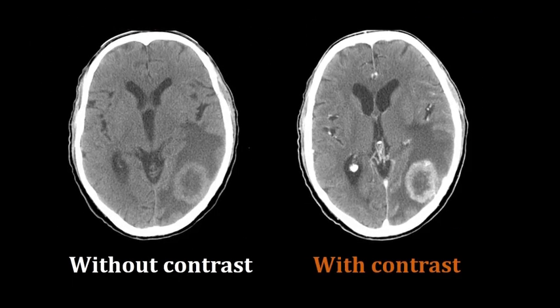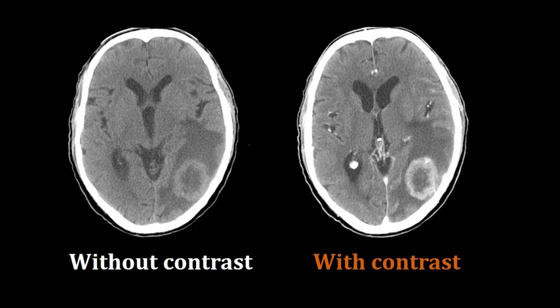These two images provide an example. The first image at the left was scanned without contrast — there is clearly a metastatic lesion but the borders are not clearly defined, and we can see there is no bleeding. The image to the right shows the same patient scanned with contrast, and now the borders of the tumor are clearly defined. If we had scanned with contrast immediately, it might have been difficult to tell if this was an enhancing tumor or a bleeding tumor.